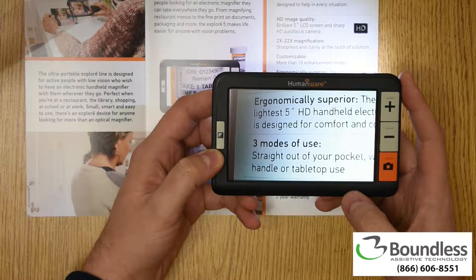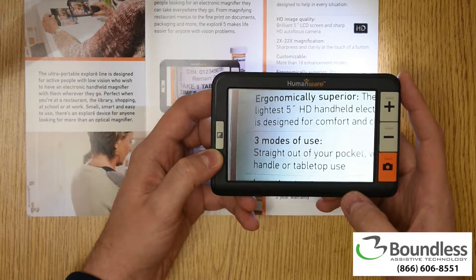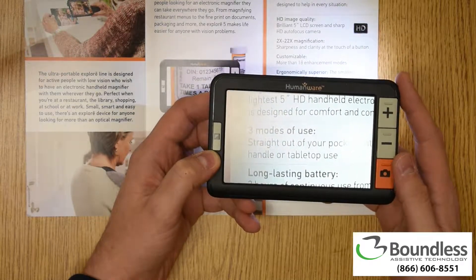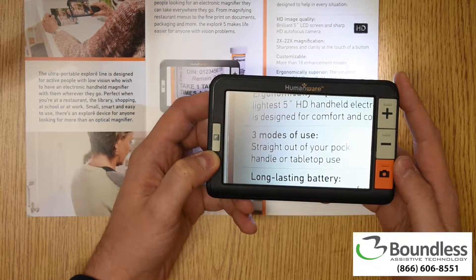As a handheld video magnifier, the Explorer 5 is a great tool for visually impaired folks looking to have visual independence on the go. Small enough to take with you, it's perfect for quick reading tasks like checking price tags at the grocery store, reading pill bottles before bed, or reading off the meal choices at a new restaurant.